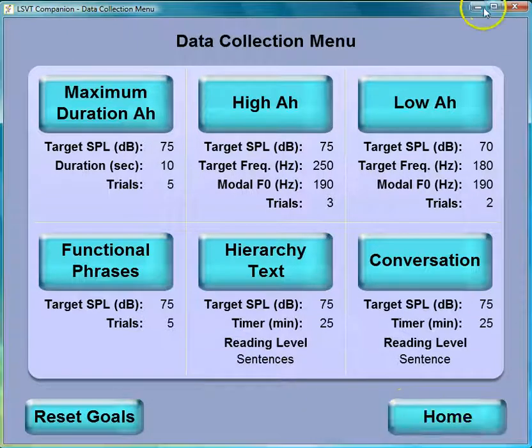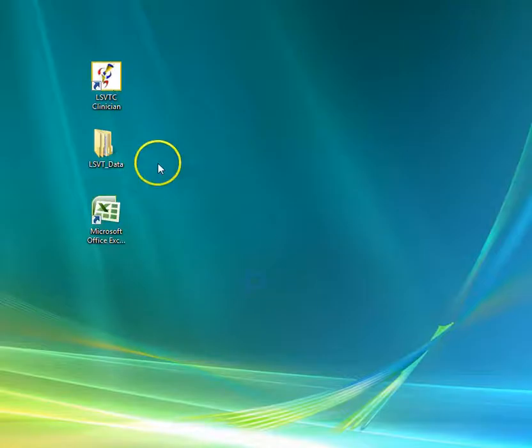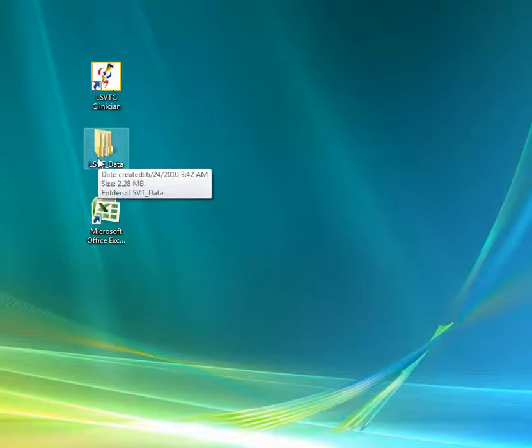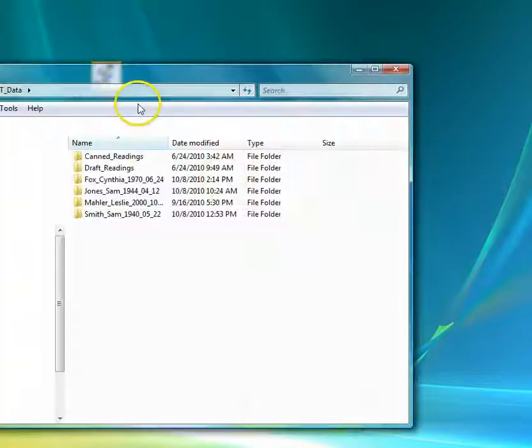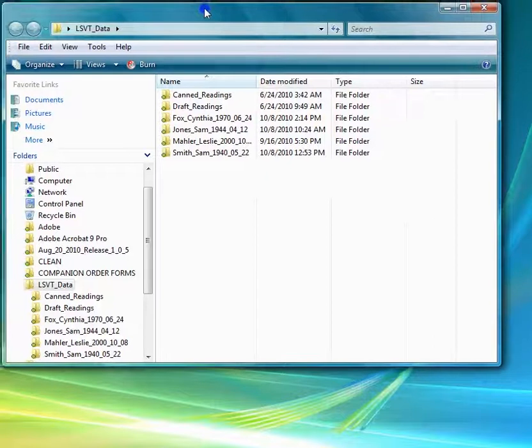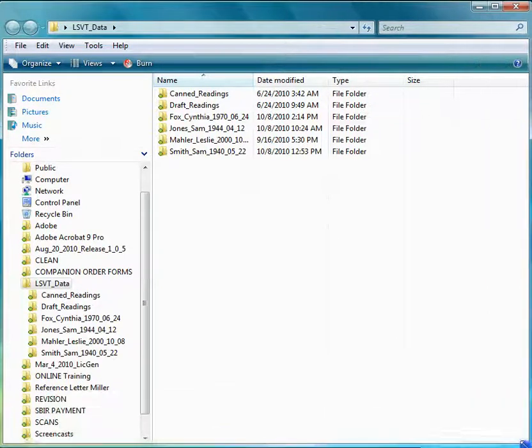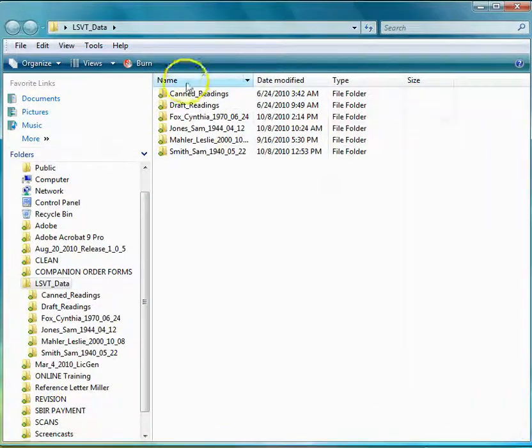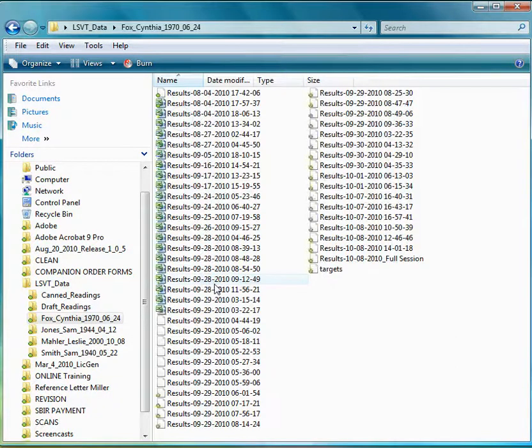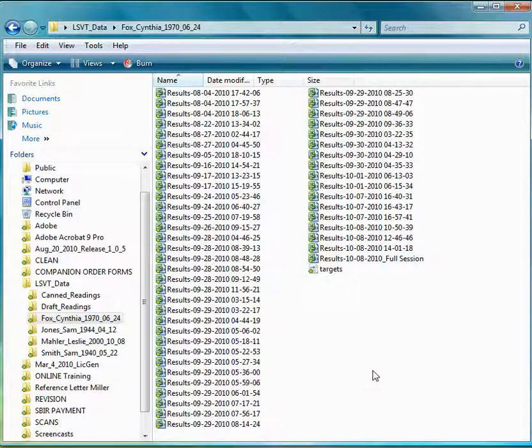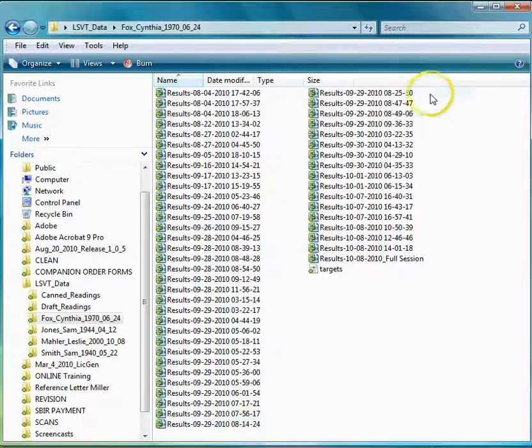At the end of the session, you'll go to your LSVT data file. Opening this file, you can select the client for whom you just collected data. In this case, we'll select the client Cynthia Fox. And you can see there are results files, which are Excel spreadsheets for every time a session was done.